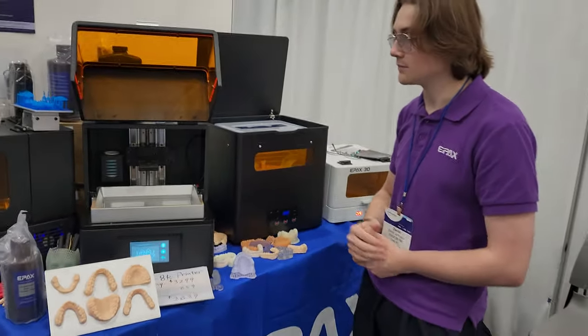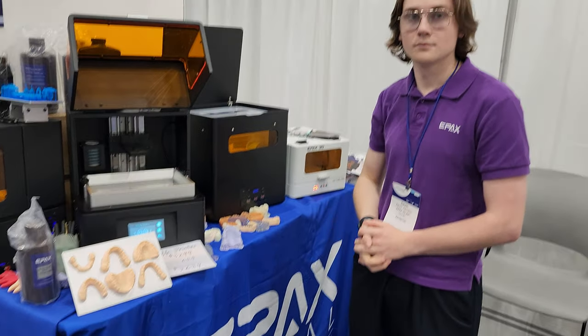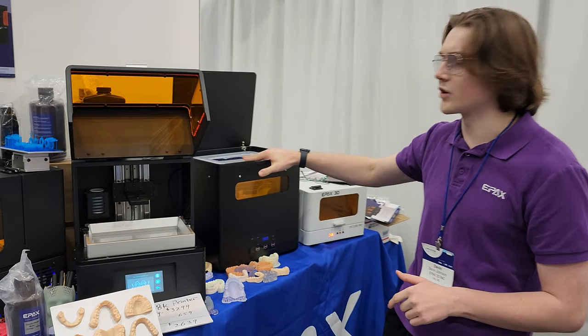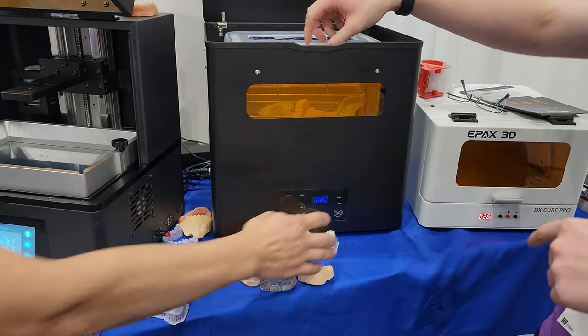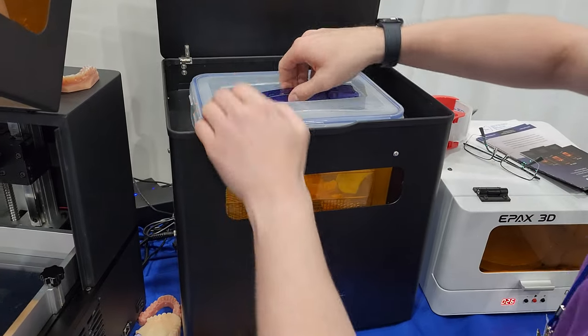So now why would you use one of these devices? What is the user going to do with the print when they're done — what are their next steps? So after they're done printing the model they're going to want to either remove it from the build plate, or you can put it into this machine right here — let me get this out so we can look at it.